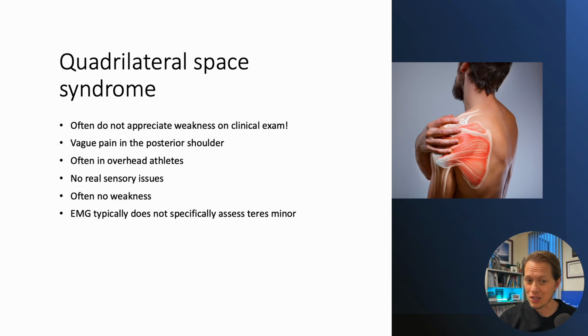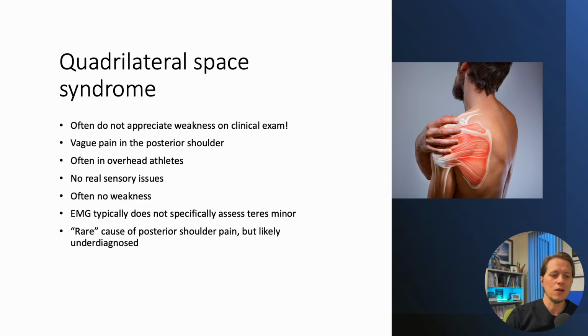EMG, if you don't do the teres minor, EMG is going to be normal. So I get it a lot only because once you do enough EMG, you start looking out for it. And if you have the ultrasound, you can quickly scan that teres minor, and then you can get a lot more answers. And I've started to incorporate a little more needle EMG of the teres minor in my practice as a result of this, but sometimes I'll often go to the ultrasound first.